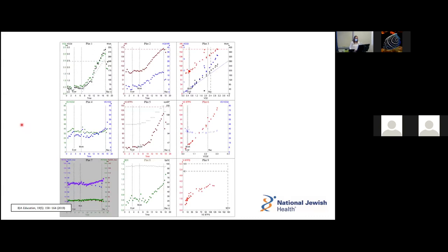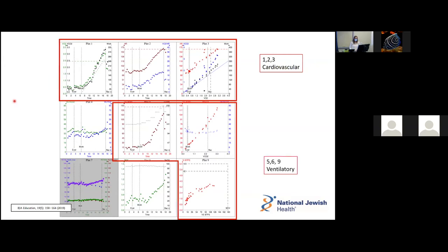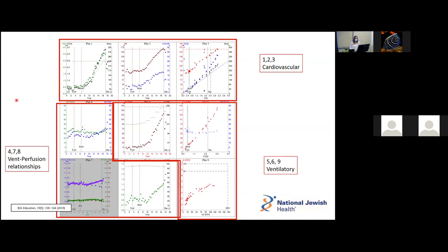The second very important page is the nine-panel plot page, usually around page eleven of the report. It's complicated with a lot of overlapping graphs, but this is where you can find all the data you need. Here at National Jewish, plots one, two, and three pertain to cardiovascular parameters. Plots five, six, and nine show the ventilatory parameters. And plots four, seven, and eight represent the ventilation-perfusion relationships. You can keep this as a reference, and we'll go through it in more detail.